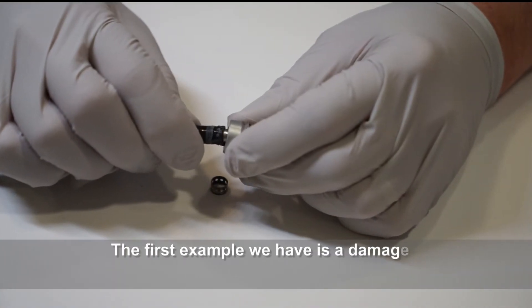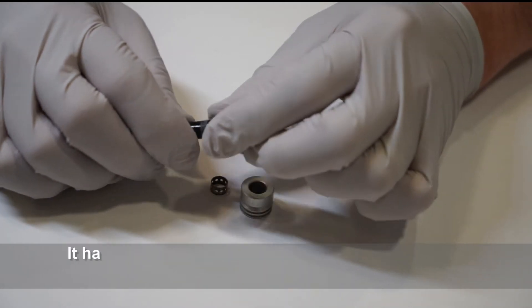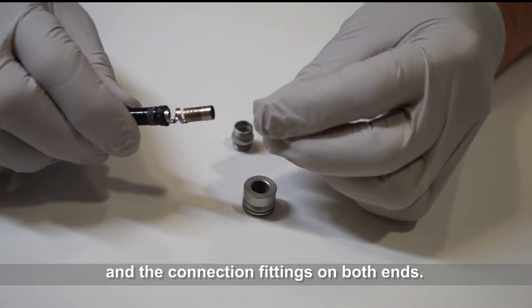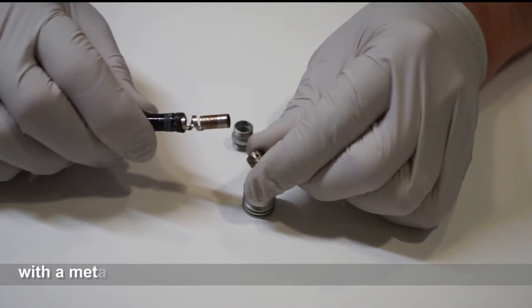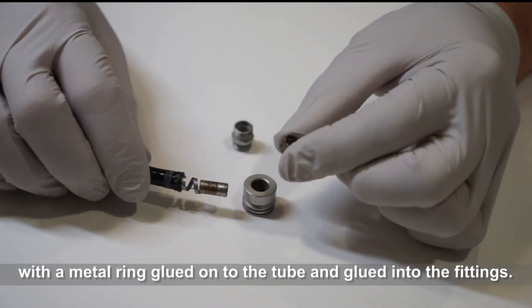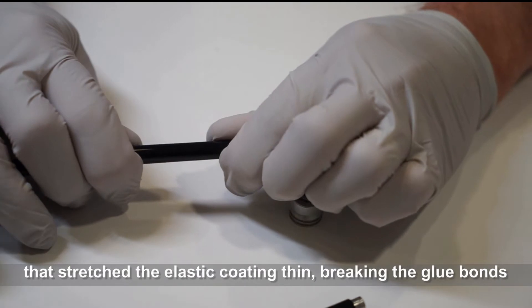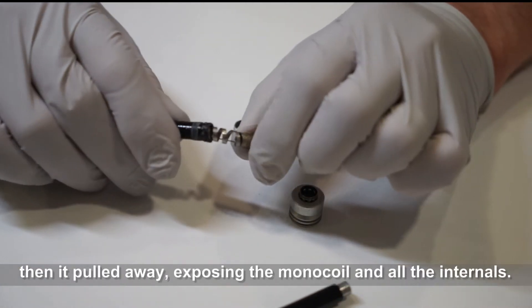The first example we have is a damaged light guide tube from the Astoris 11272VN. It has a thick elastic coating that detached from the inner monocoil and connection fittings on both ends. We found that the outer coating was actually only held at both ends with a metal ring glued onto the tube and glued into the fittings. The separation most likely happened when the doctor pulled on the cable, stretching the elastic coating thin and breaking the glue bonds, then pulling away and exposing the monocoil and all the internals.